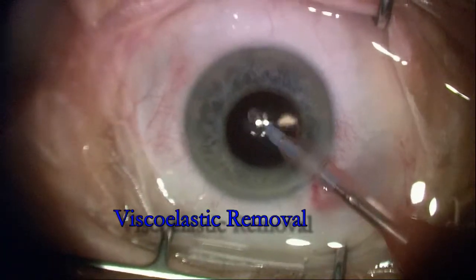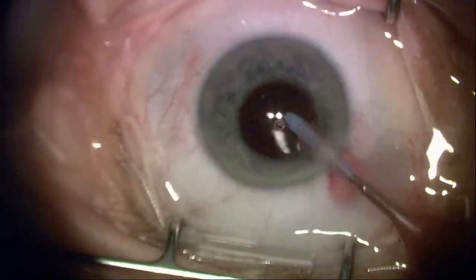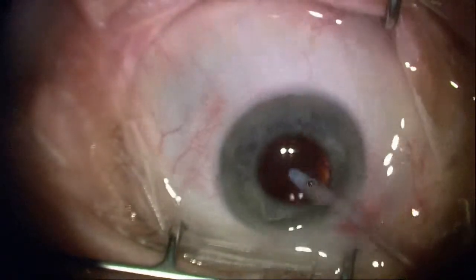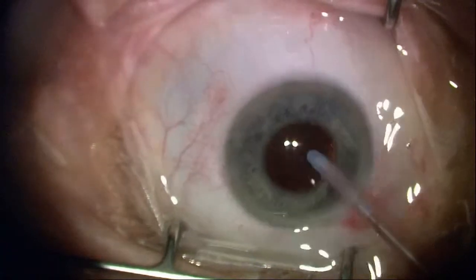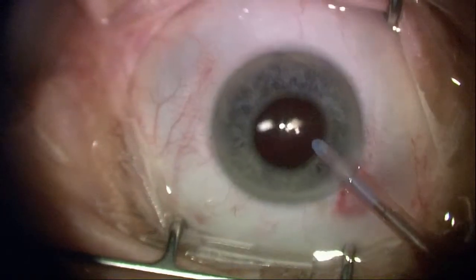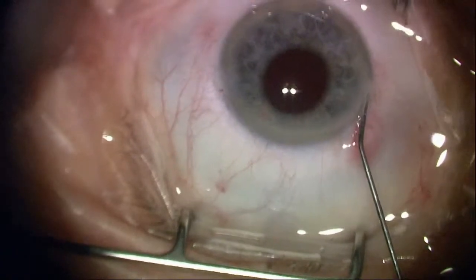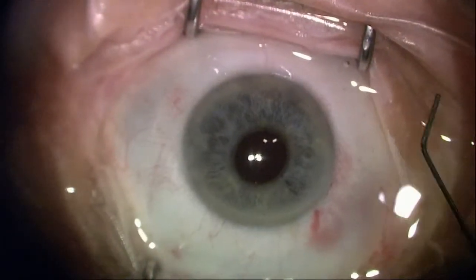You have to be careful if you're going to use a silicone lens or one that opens up very quickly, as that could tear the capsule. Removing the viscoelastic, taking some extra time to make sure I don't have any trapped behind the implant. I'm going to be moving the implant side to side, pressing posteriorly and trying to squeeze that viscoelastic anteriorly for complete removal. Once I'm confident I've removed it all, I'll hydrate the paracentesis to make sure I don't have any residual particles there, and also close the wound and then the main wound and check the pressure.